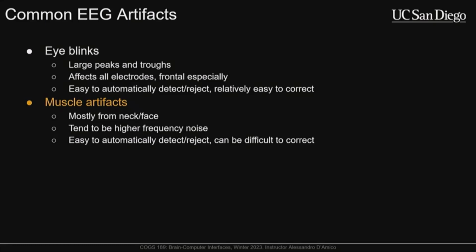They tend to be localized in higher frequencies, typically 30 to 100 hertz, which is where you'll see a lot of those muscle signals.